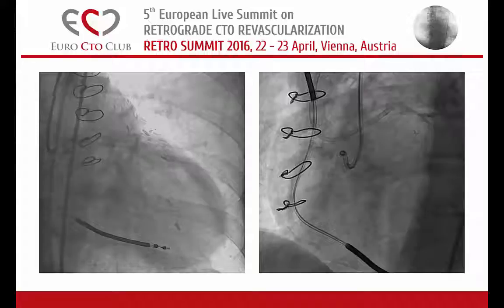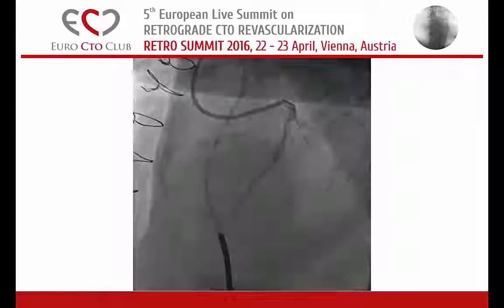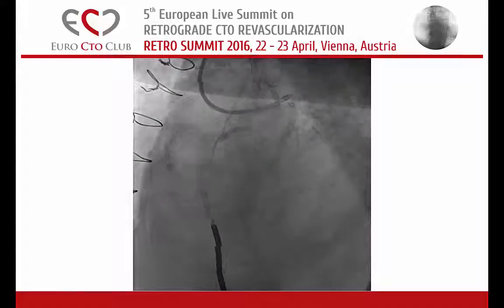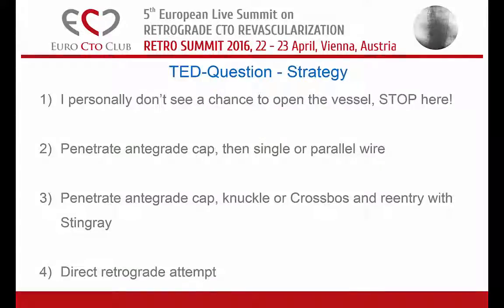Here we are going — it is a double injection and as you can see here, it was really an ostial occlusion. Ostial occlusion of the RCA — really very calcified, ostially occluded lesion. The question I ask myself is: I personally don't see a chance to open this vessel. I was thinking a lot about this vessel with an ejection fraction of 24. Do I penetrate the antegrade cap and try a parallel wire? Do I penetrate the antegrade cap, knuckle down, CrossBoss and Stingray, or try to go direct retrograde? What is your preferred strategy in this case?